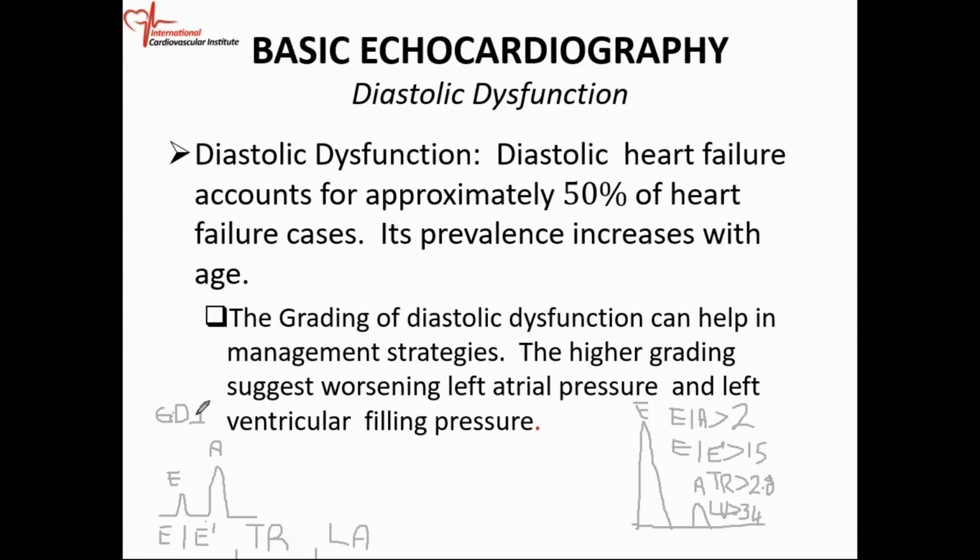Your grade 3 patients have a problem with compliance. The heart is non-compliant, stiff. So this is grade 3. Remember, your grade 1 patients are not very sick. It's the earliest stage of diastolic dysfunction. Your grade 3 patients are very sick, and the numbers will reflect that.